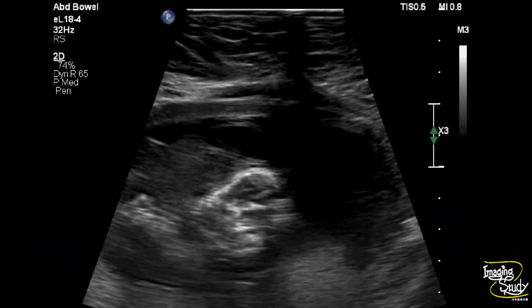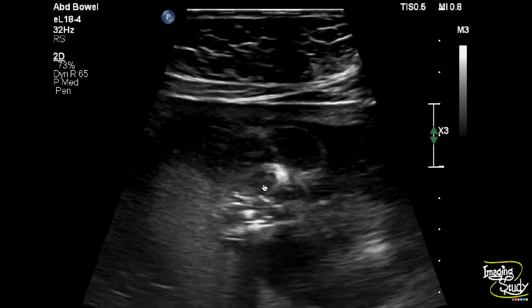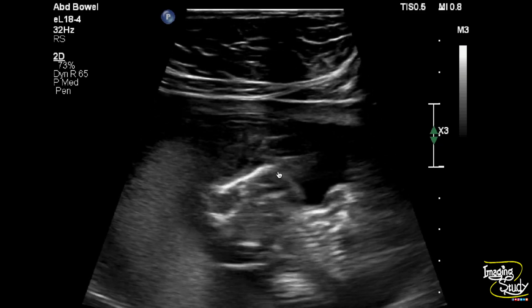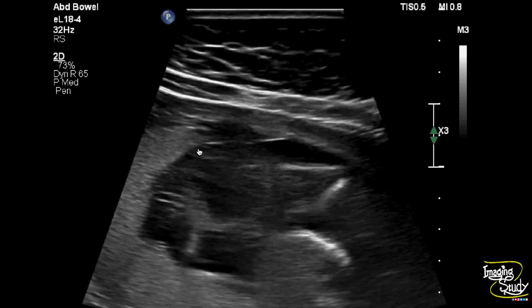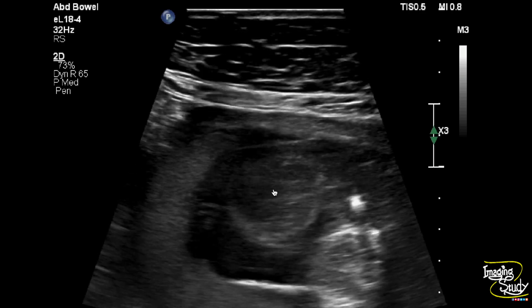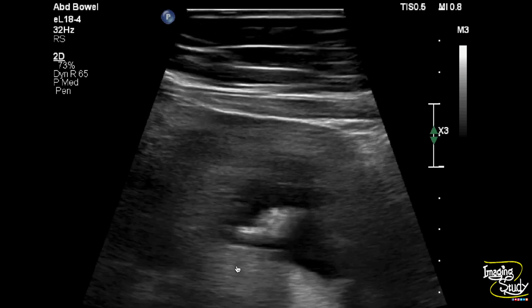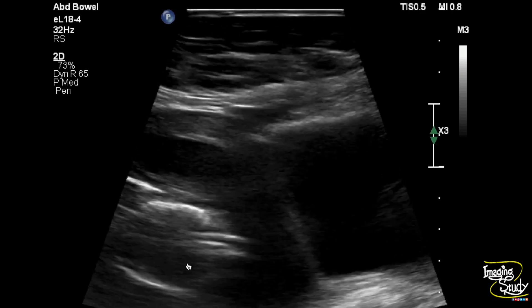Here is a high frequency view and you can see the calvarial bones are present. We have got a defect and through it the brain matter is herniating outwards with some fluid and obviously the meningeal covering.